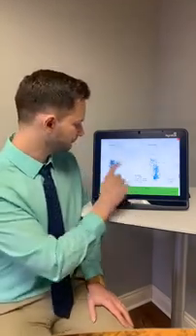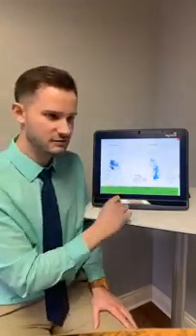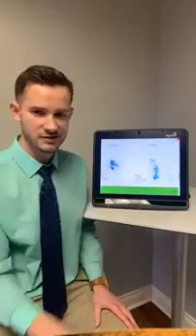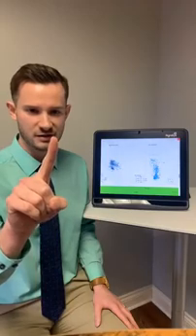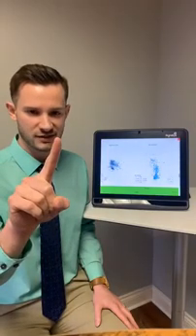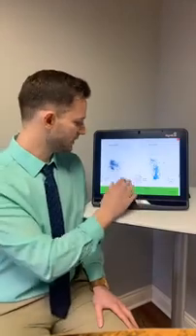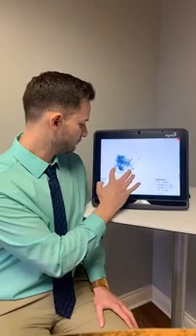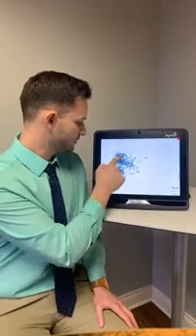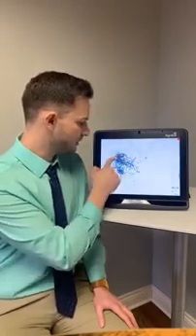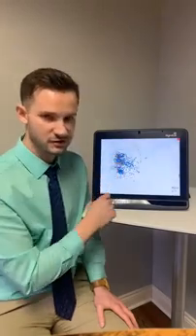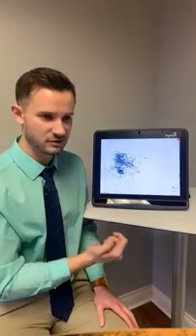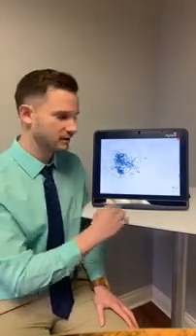So this test looks at, for 21 seconds, three rounds of seven seconds, they're instructed to just look at a target. Look very still right at this target. Don't let your eyes move for seven seconds. And we do that three times. Every millisecond we get a measurement of where their eyes are at. Let's look at the right eye first. Right eye did actually pretty good at keeping a lot of data points pretty centralized in that bullseye, but the patient did drift off pretty frequently too. Difficulty with holding the eyes steady.